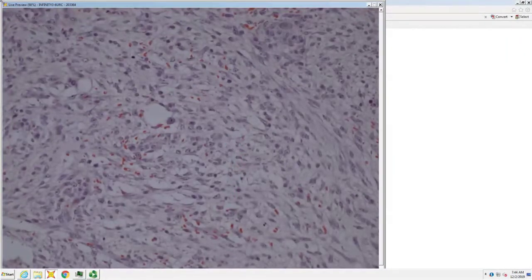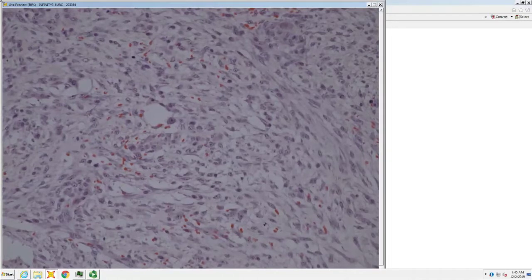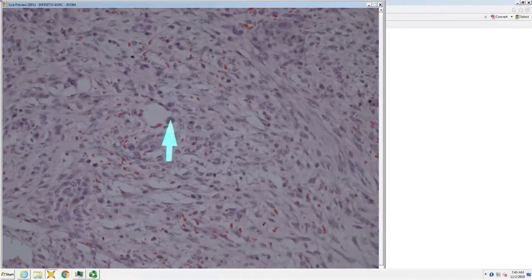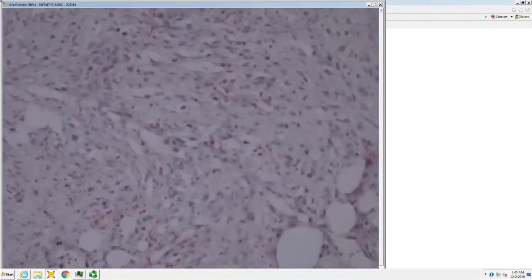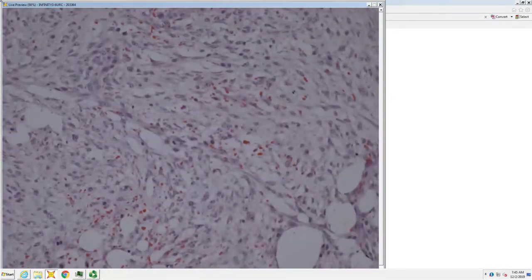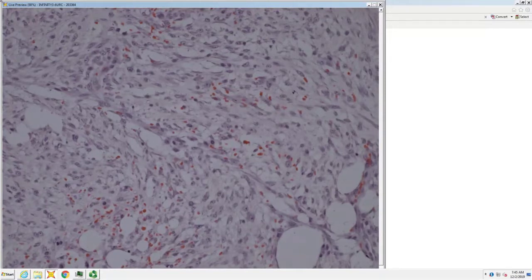And is it uniformly hypercellular with no pleomorphism? Because DFSP, being a translocation sarcoma, will be uniformly hypercellular with no pleomorphism. I see variation in nuclei and variation in density, so it doesn't really look like a translocation sarcoma. Right. Translocation sarcomas should be uniformly hypercellular across the field. Really no pleomorphism. All the nuclei are the same, just way too many of them.